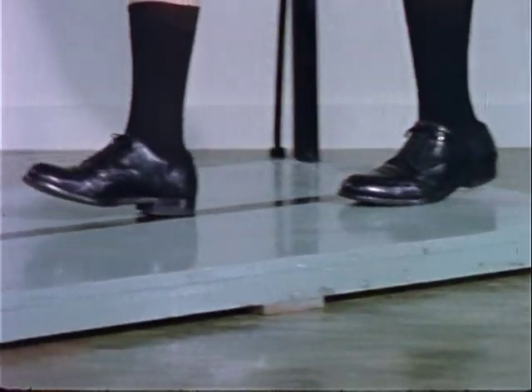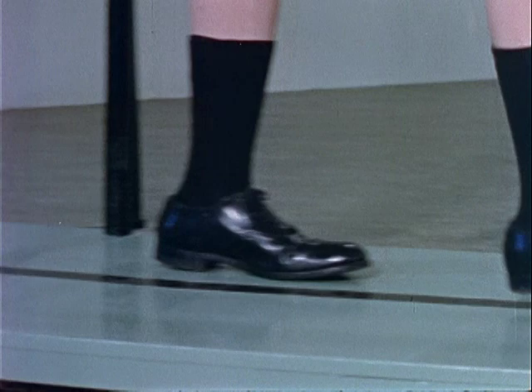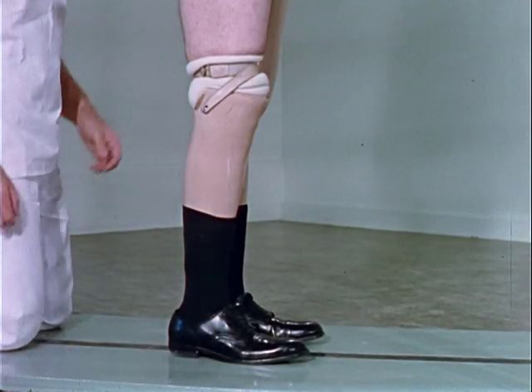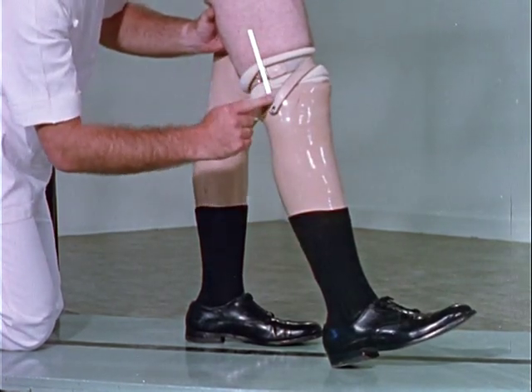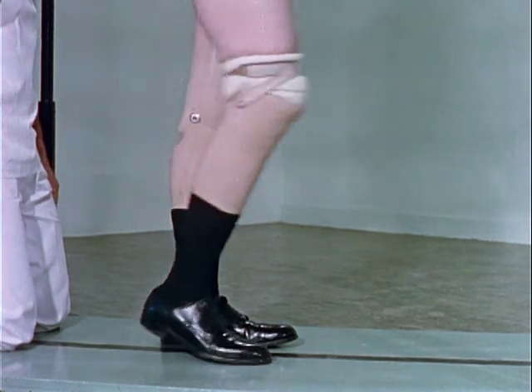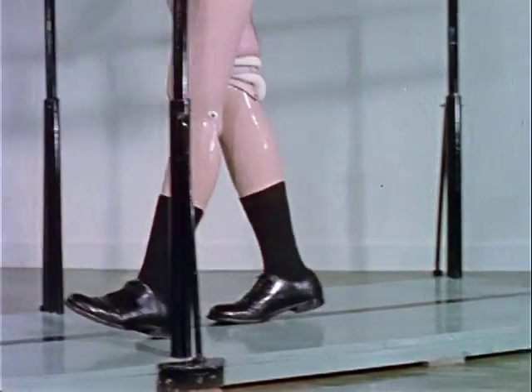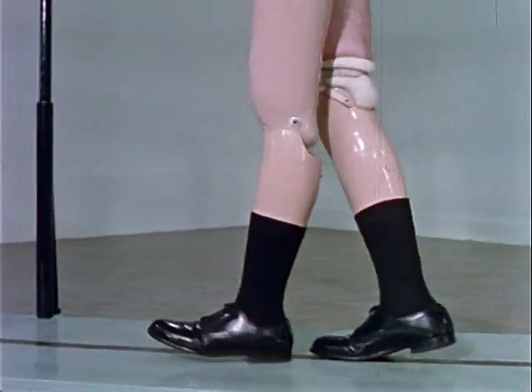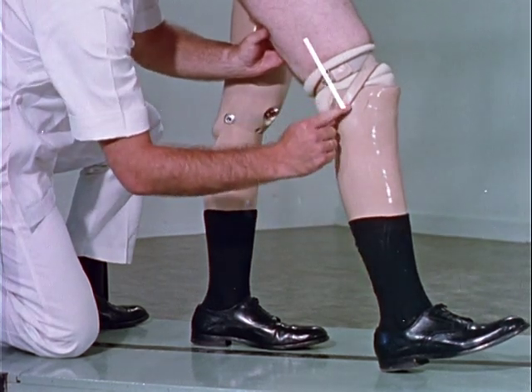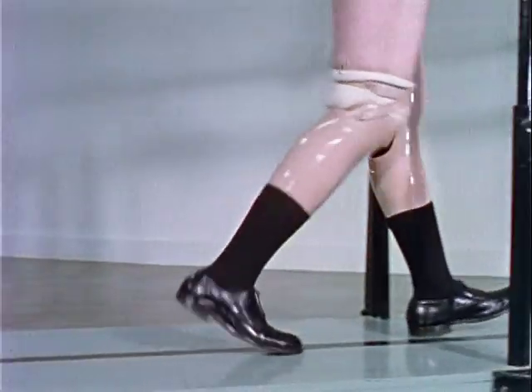Unequal step length is a common problem which ordinarily can be corrected by training. One frequent mistake in using the patellar tendon-bearing prosthesis is hyperextension of the knee at heel strike. It is more often seen in amputees who have previously worn a conventional below-the-knee prosthesis. Hyperextension of the knee can be related to failure to decelerate the lower leg by hamstring contraction. The correct relationship of the prosthesis to the femur at heel strike is approximately 10 degrees of flexion. The knee should remain flexed from heel strike through mid stance.